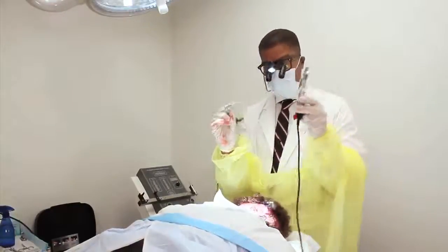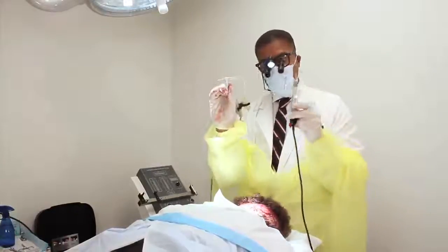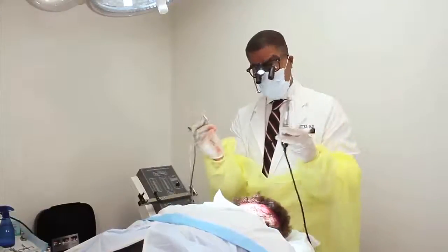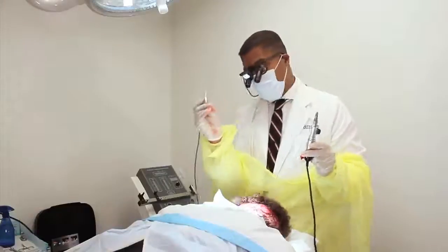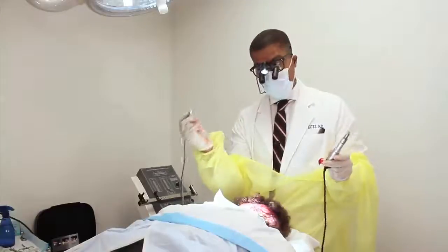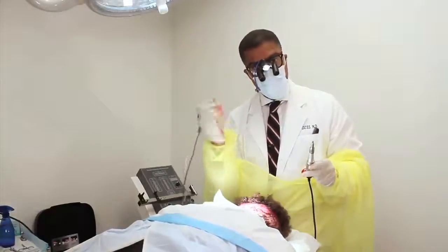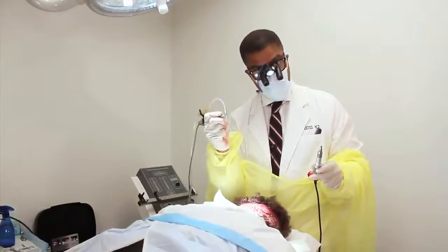There's nothing magical about any of these instruments. This is the Harris Safe System, and this is the Neograph — I have the famous Neograph in my hand. You can see they look kind of similar. It's all personal preference of what you get good with. If you're good with one, use it. But the Neograph is not mechanically equal to the ARTAS robotic system, because this is held by a person, and the person's skill determines how well the procedure goes.